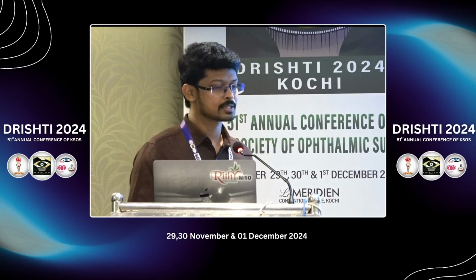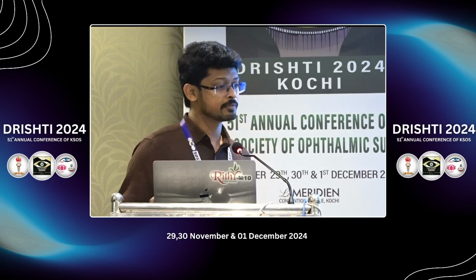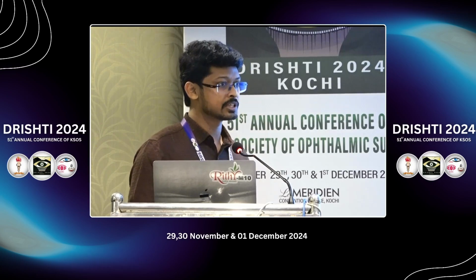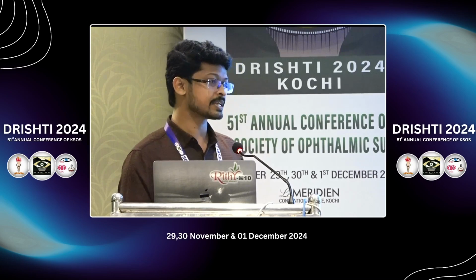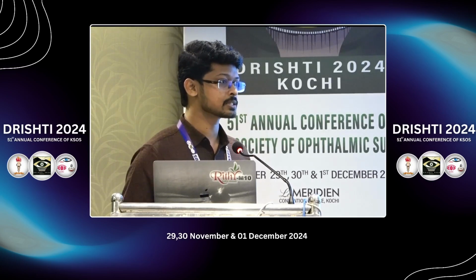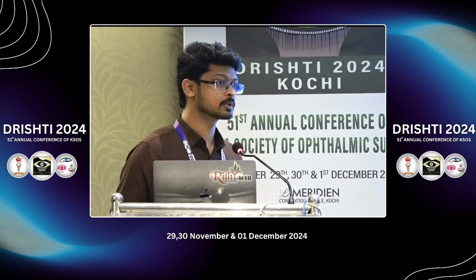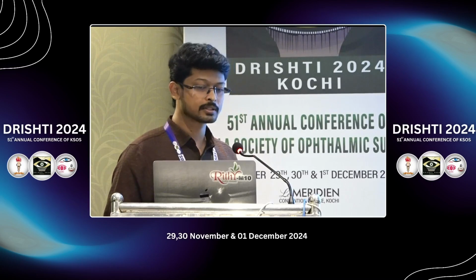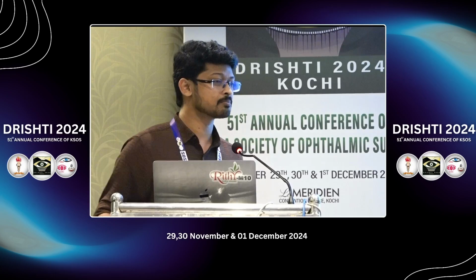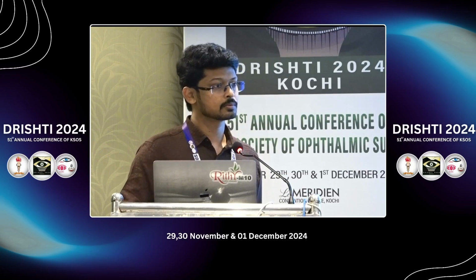If we find any changes in fundus examination or any early symptoms, we could pick up early CNVM or neovascularization layer by layer without dye injections in the patients. So it will be useful for patients having any contraindication for dye injections, madam. Okay, right. Was there any patient with no improvement in spite of treatment? Yes, ma'am. There were 10% of patients. Without any etiology? No, not many.